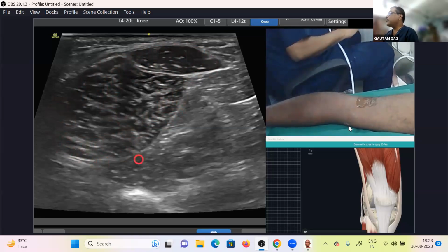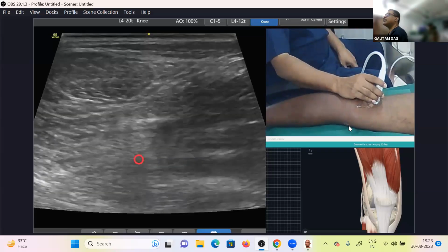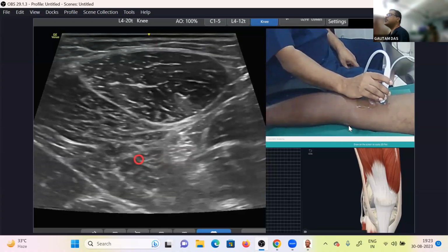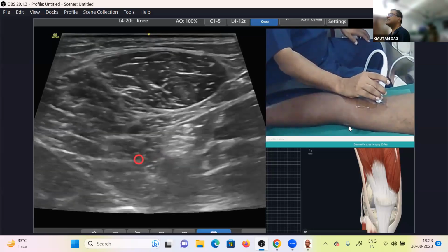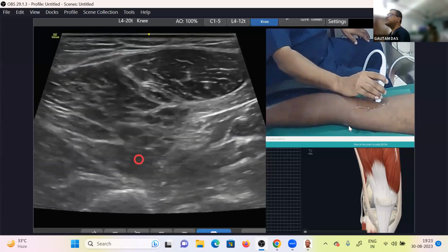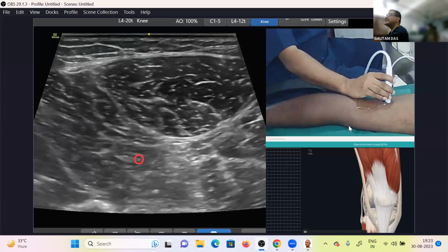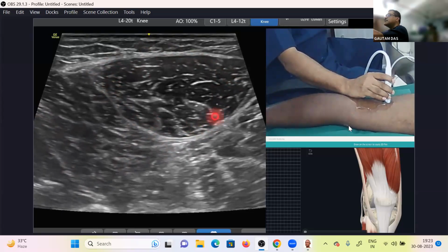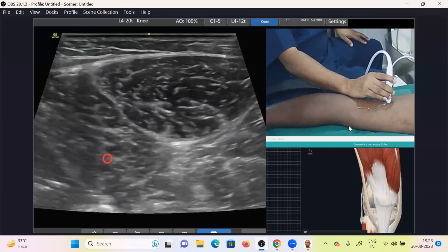Okay. So if I am going above, both the heads are almost equal. And if I'm coming down, you see, the long head is becoming shorter, short head is becoming larger. Can you appreciate? If I'm going above, the long head is becoming larger, short head is becoming shorter. This is almost horizontal, two lines, but this is a little bit elliptical. This is your long head, this is your short head. Can everybody appreciate? Yes, sir.